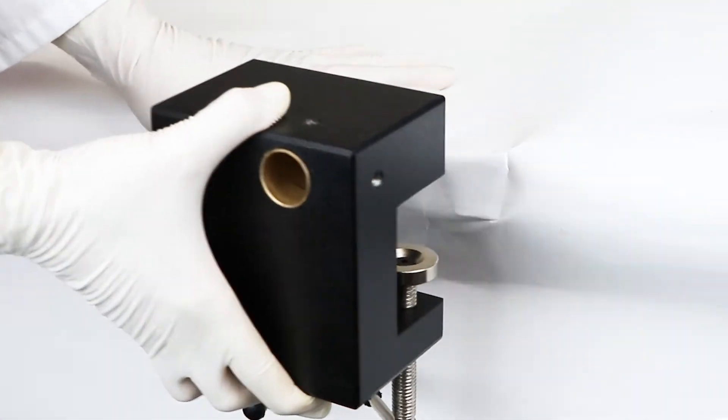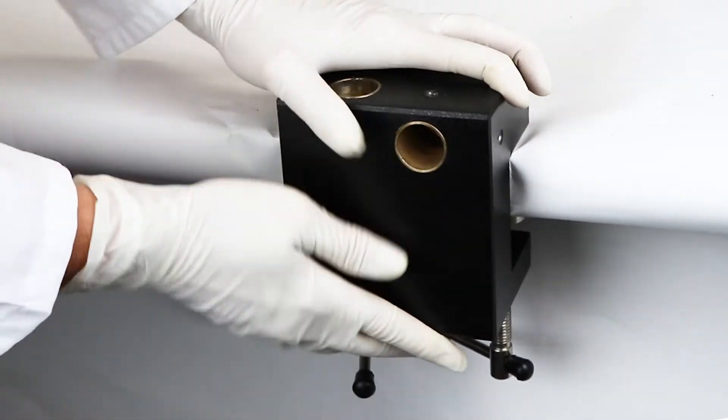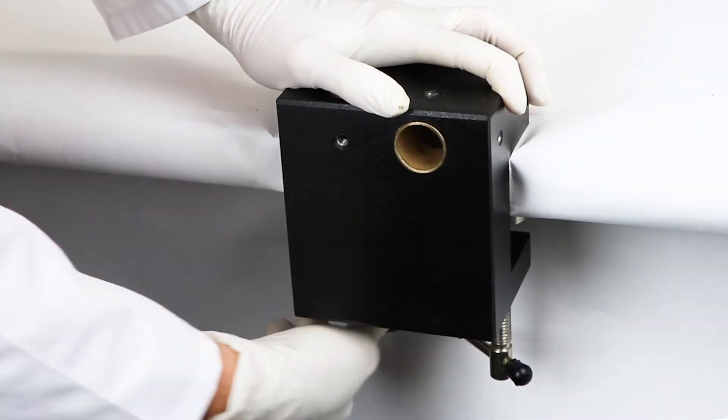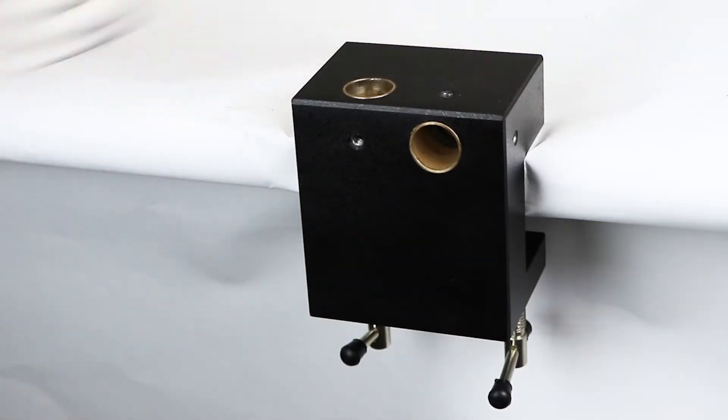Loosen the two screws on the table clamp. Position the clamp so that it wraps around the edge of the table with the screws located under the table. Then tighten the screws to securely mount the stand to the table.